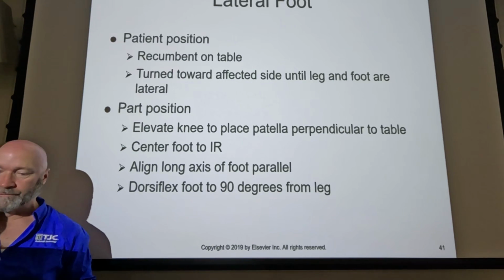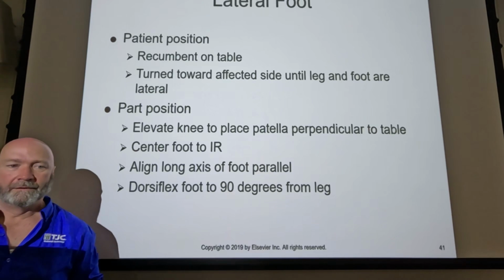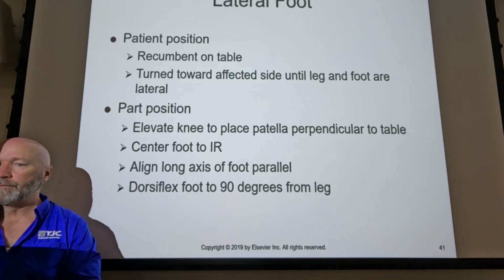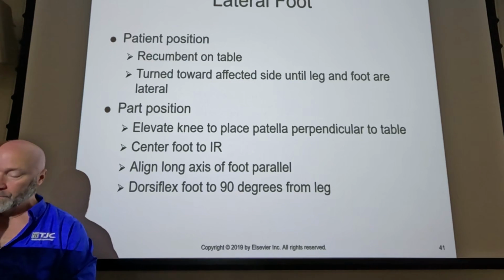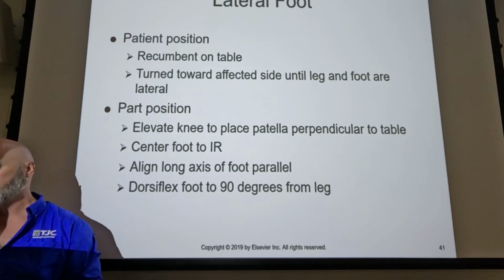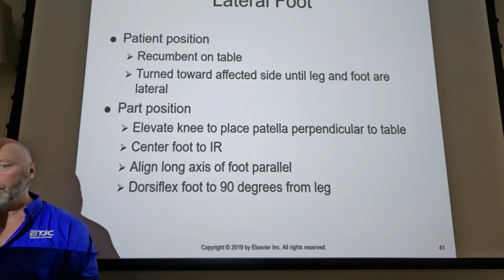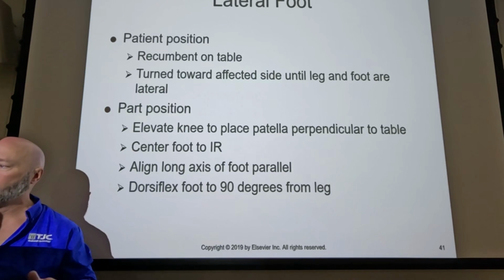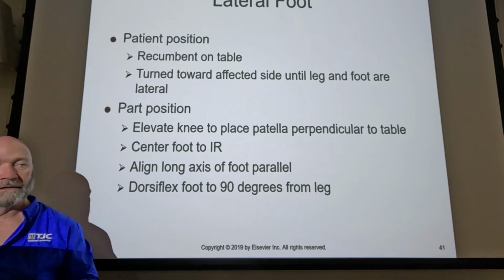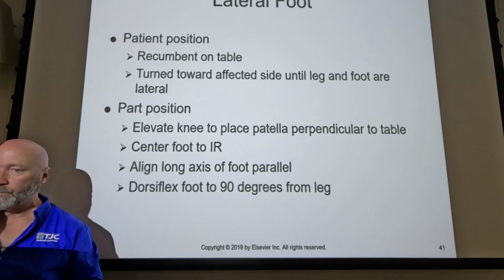You can take your image receptor, make sure the floor is clean, and put the image receptor on the floor, put your patient's foot on the image receptor that's on the floor. Your tube will come down to 40 inches from the floor, right? So you bring the tube down to 40 inches. If you're doing toes, 15 degrees cephalic angulation. If you're doing feet, 10 degrees cephalic angulation. You can shoot them still in the wheelchair.